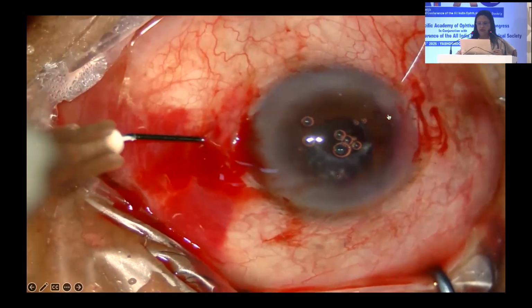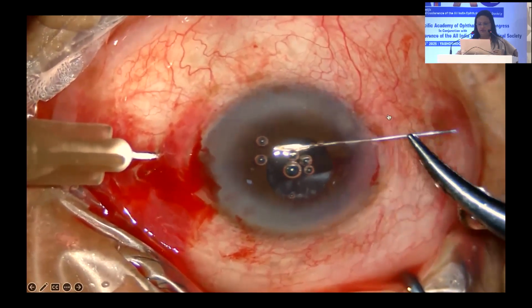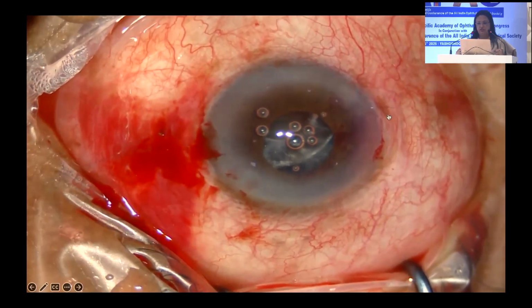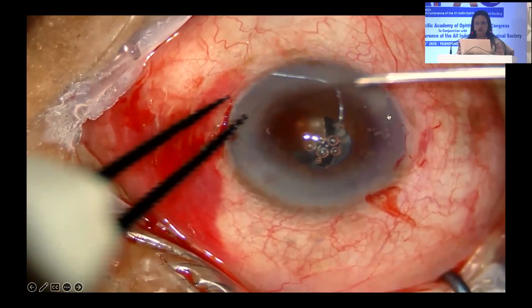I've made one loop. Now the second end of the needle is going on top. The first one went underneath, the other one goes on top, whichever way you want. You can see the lens is being pulled towards one side. And now you leave it like that. You just trim the sutures and leave it like that.